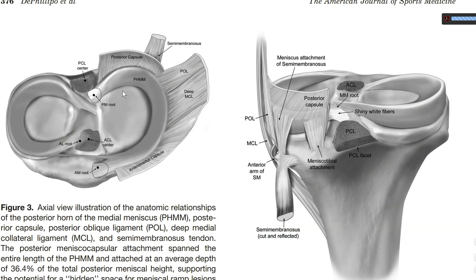Another nice image shows the posterior joint capsule blending in with the posterior oblique ligament and the deep MCL layer — this is the area of interest. You can also appreciate that the meniscotibial ligament is not as broad as the joint capsule insertion, which is broader, so it stops at some point.